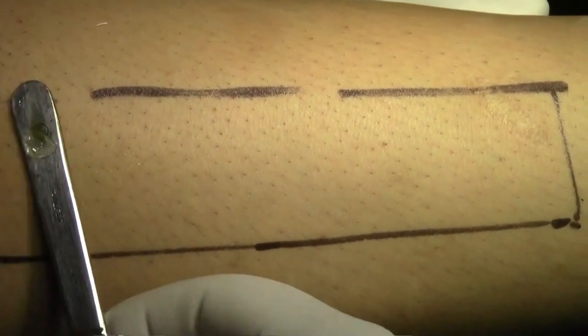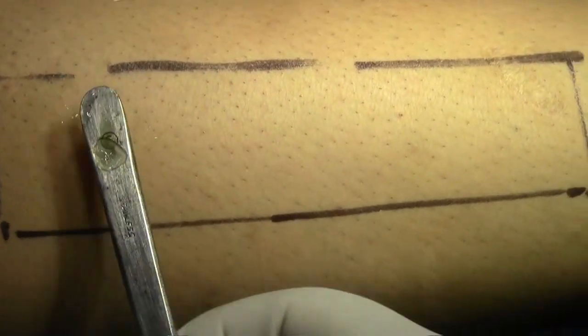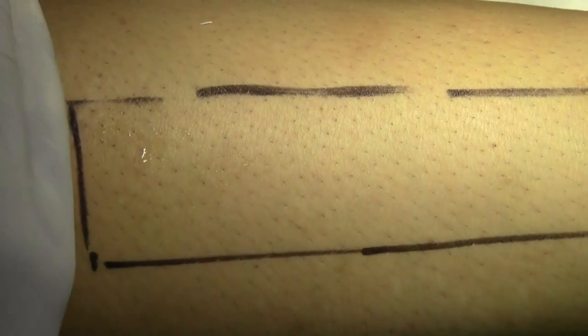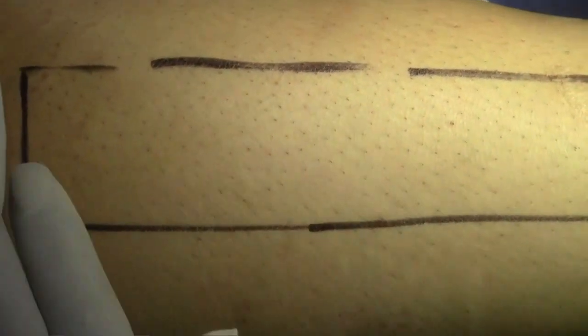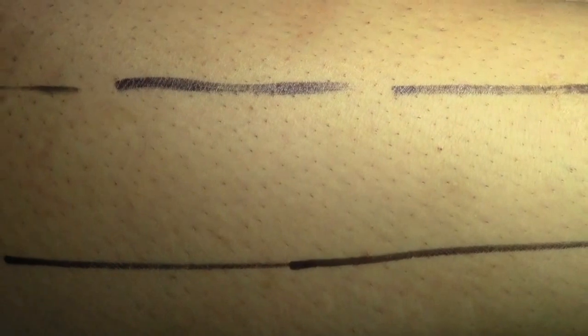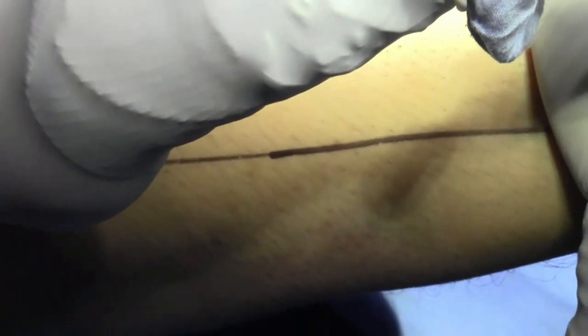Harvesting split-thickness skin graft from the lateral aspect of the thigh. The assistant holds the skin taut. I have lubricated this area with normal saline only, holding the blade tangential and then tilting it by 10 to 15 degrees.